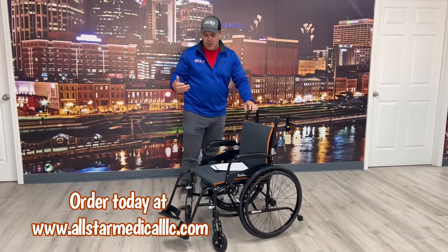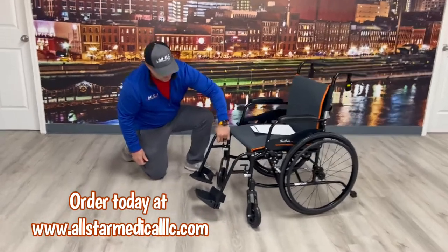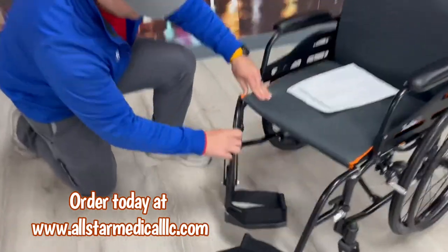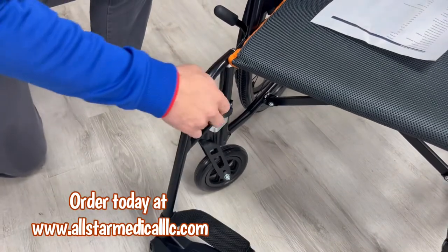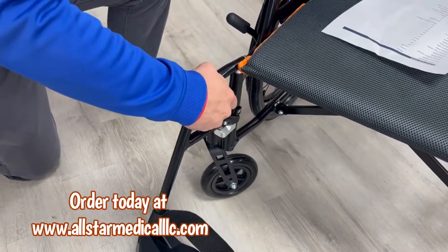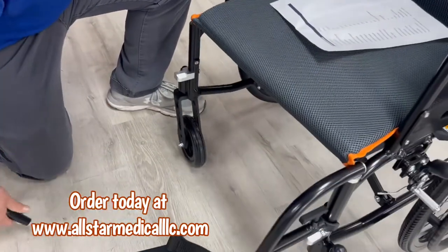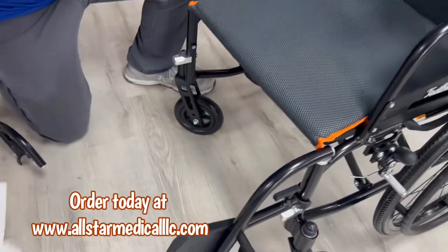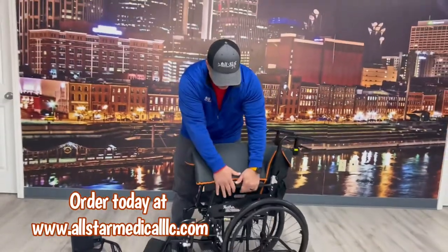The leg rests will actually come in and you can roll them out, or even detach them if you choose to. So you have the option to detach them if you want.